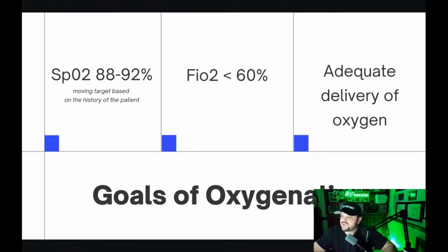We shoot for FiO2 less than 60%, getting back to this animal data, maybe some human data, that over 60% is deleterious. And certainly you want it to be as low as possible. And as the patient gets better, it should be lower and lower and lower. If you notice on the Servo U ventilator, if it goes above 60%, it changes color. It's like yellow or something, which is letting you know that, wow, this is a lot higher. This is a lot of oxygen.